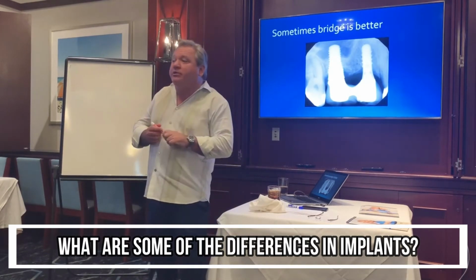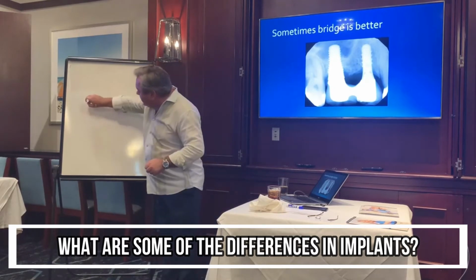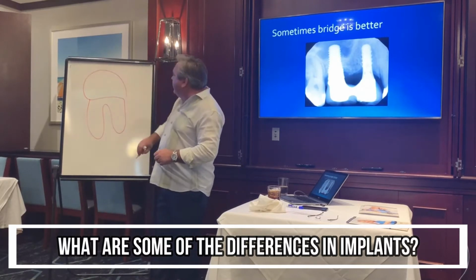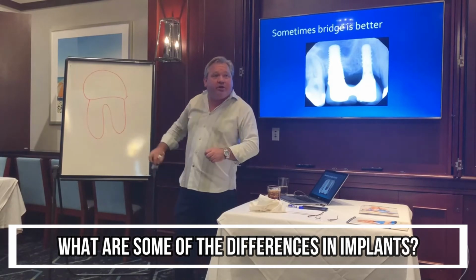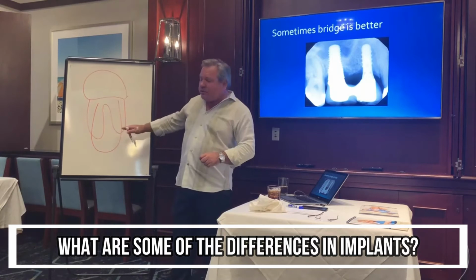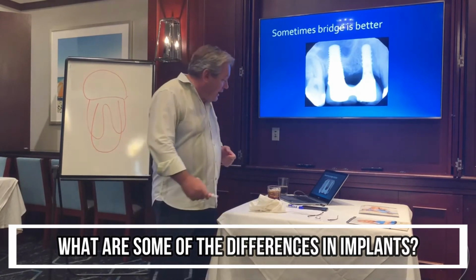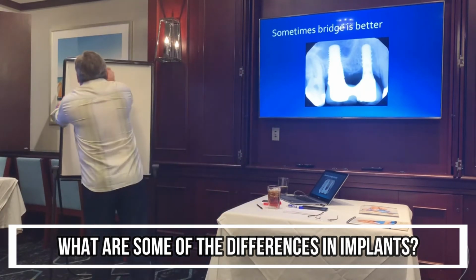Mother Nature compensates for that difference in density of bone. If you look at a lower molar, it has two roots like this. Now Mother Nature, to compensate for that lack of density in the upper jaw, adds a third root called a palatal root. Here, that root's bigger than the other two roots combined in surface area. So Mother Nature does something to compensate for the difference in density of bone. So when we do our implants, we have to do the same thing.